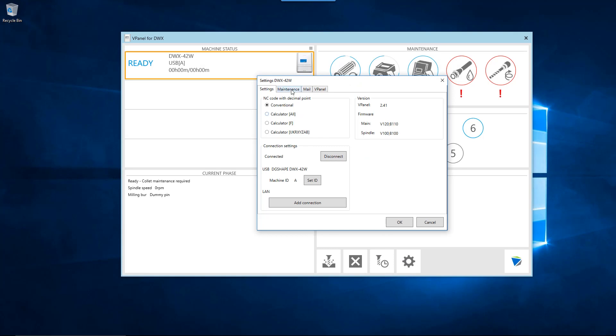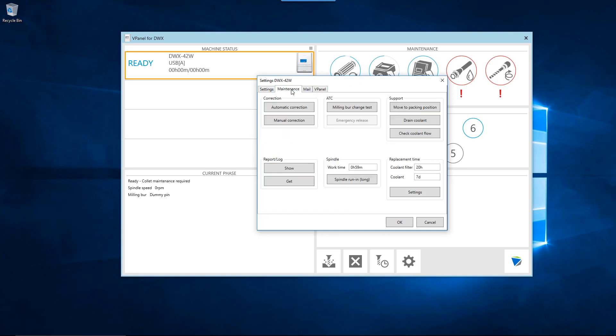Click on the Maintenance tab. Then, click on the automatic correction button in the corrections section of the Maintenance tab.